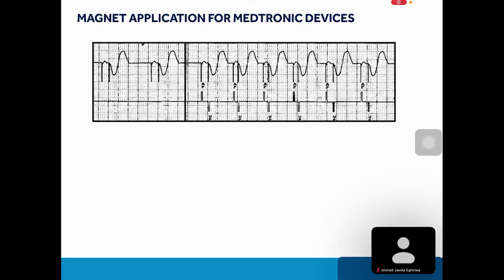The other rate is a slower rate. It indicates that this battery is at end of life or needs to be replaced.